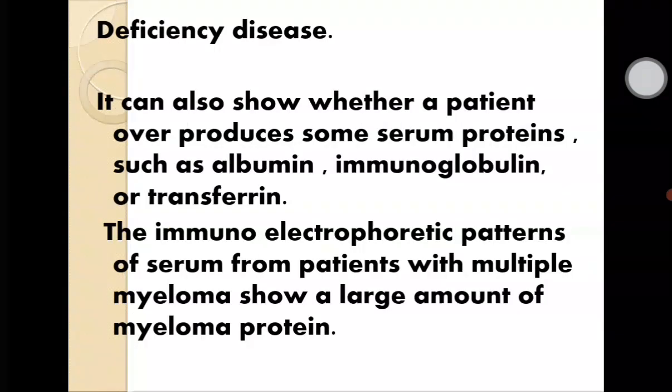It can also show whether a patient overproduces some serum proteins such as albumin, immunoglobulin, or transferrin. The immunoelectrophoretic patterns of serum from patients with multiple myeloma show a large amount of myeloma protein.